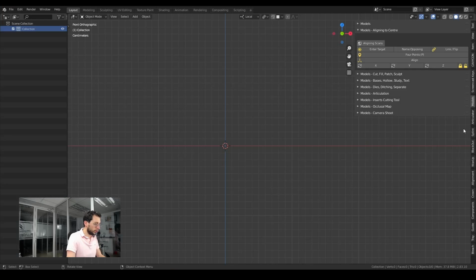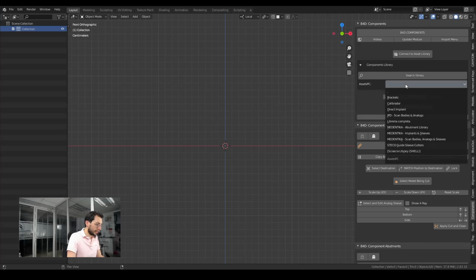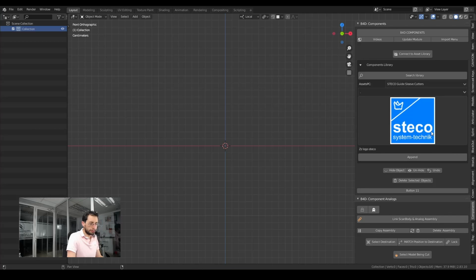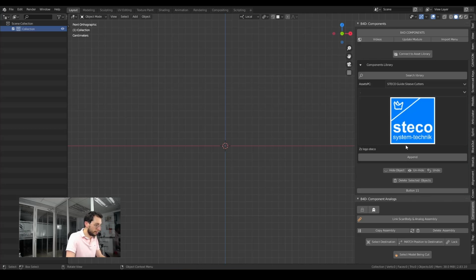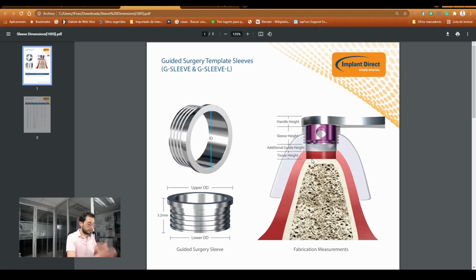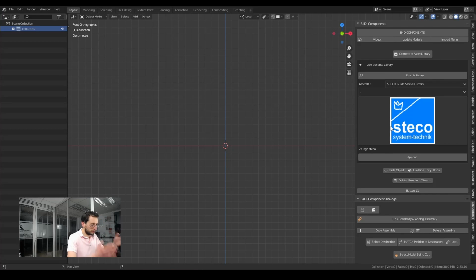Anyway, if you go to the components module, which is the module from Blender for Dental that has all these parts and all these components, you can go to the Steco company, and there you will find some or most of these sleeves, or these metal cylinders, however you want to call it, from the main companies, okay? Straumann, MIS, BioHorizons, etc. However, as you can see, there is no Implant Direct in here. So how can we make one exactly like so in order to work with Blender for Dental?